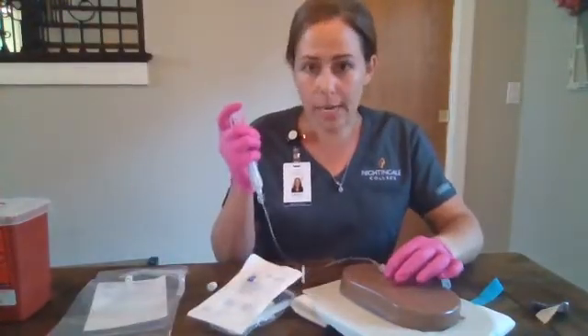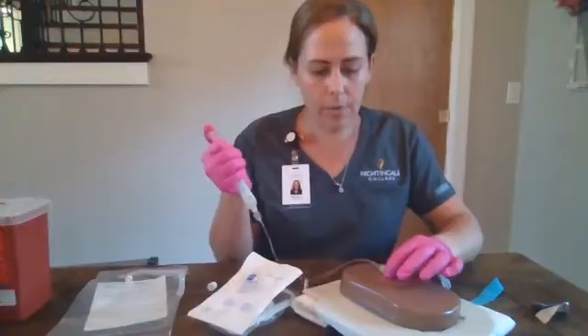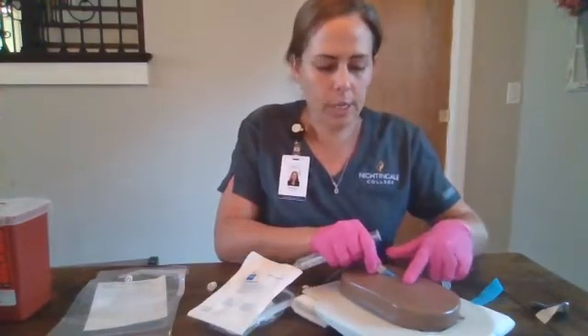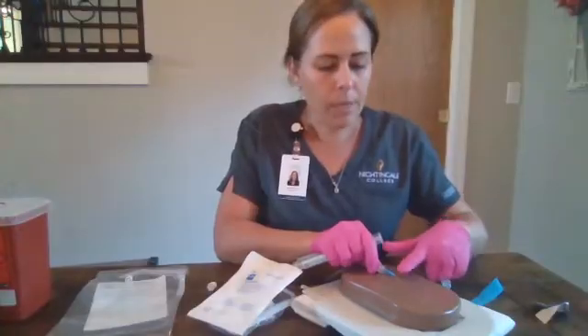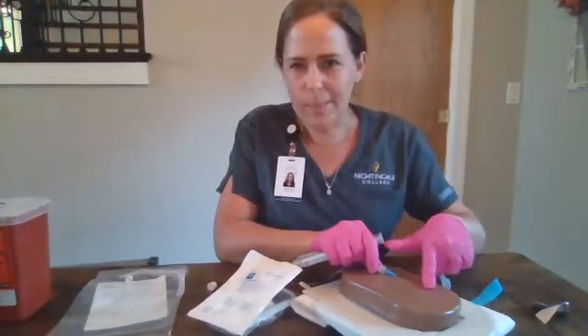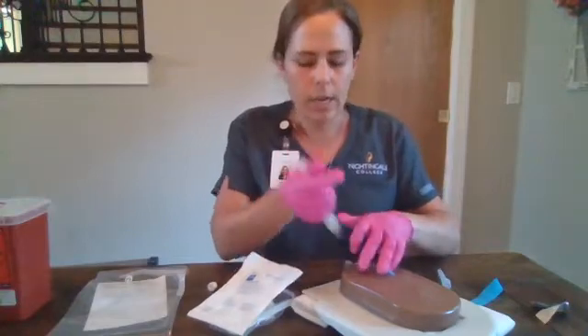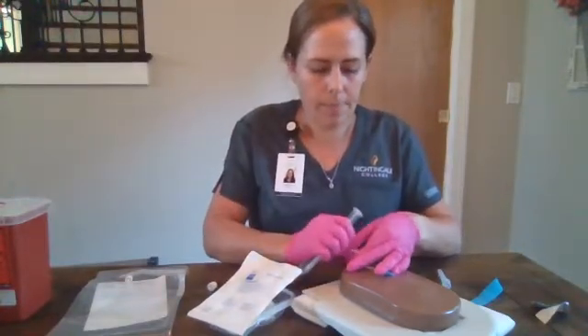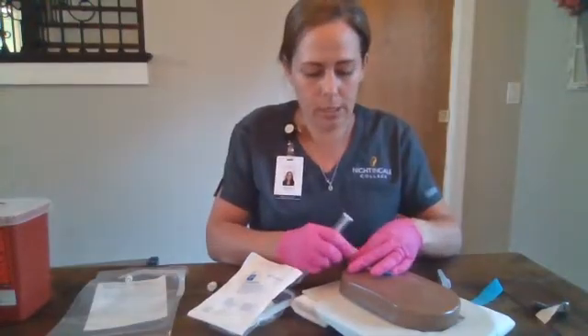We are going to aspirate for blood and then we will flush. We're going to look for any signs of infiltration — any bleb forming with that saline push, any pain, discomfort, discoloration, any signs that we need to restart that IV.